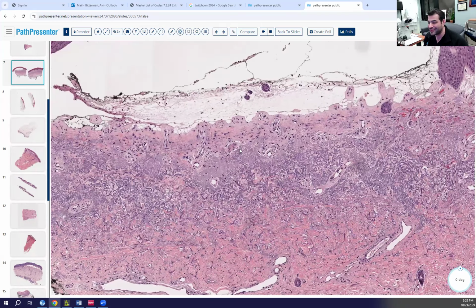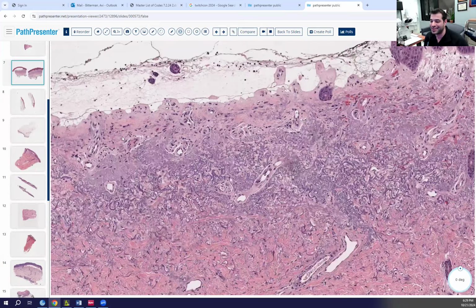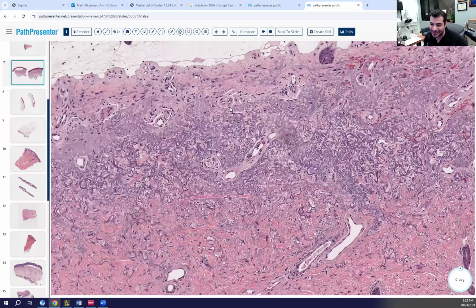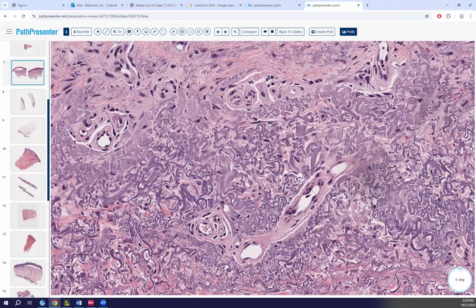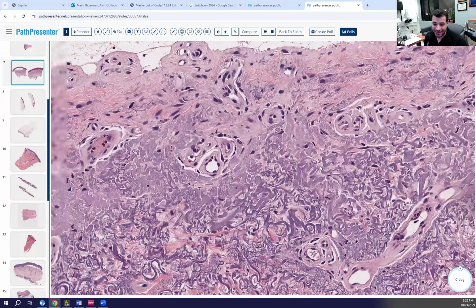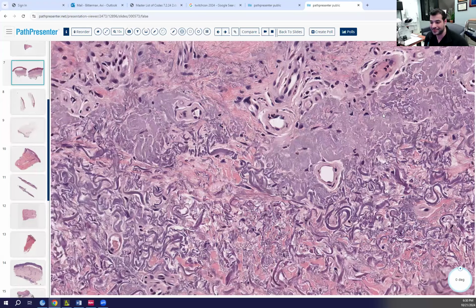The reality is we have a lot of findings here, and you don't need solar elastosis. If we didn't have the solar elastosis here, we still have the caterpillar bodies, we still have the festooning, and we still have something else. Another finding. Vascular infiltrate. Well, there's an infiltrate, but there's something else going on. What's going on around the vessels, besides some sparse infiltrate?